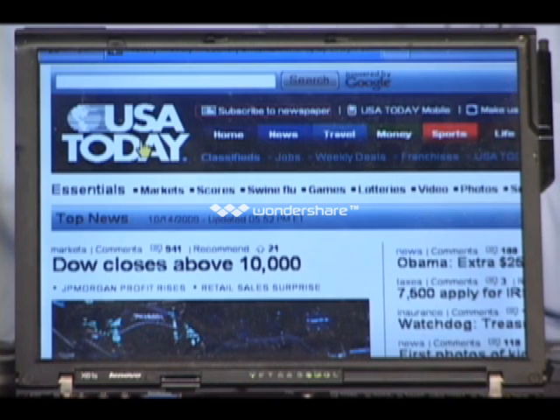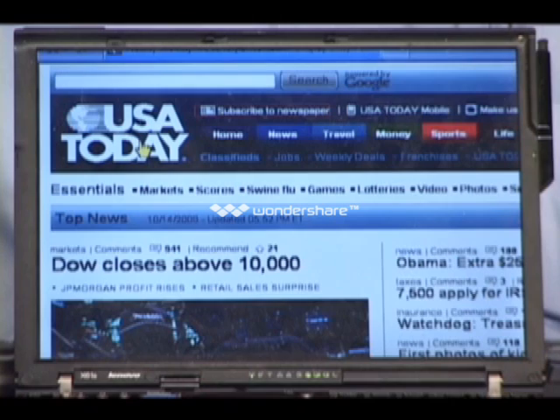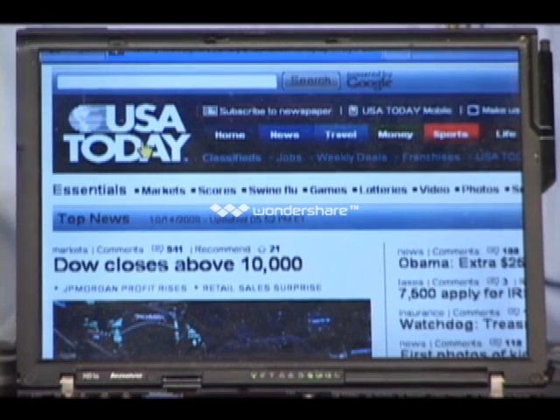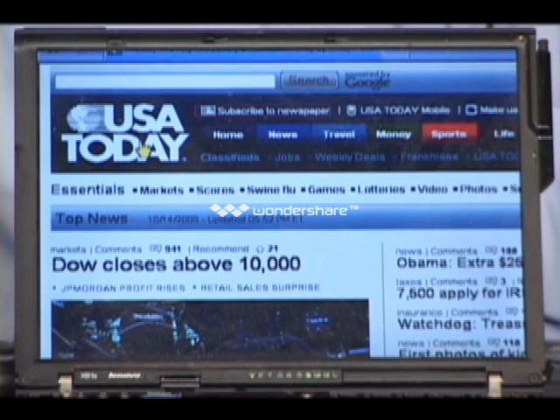Magic, however, has two versions. One is magnification only. The other is magnification with speech. Now, the speech version has not as much speech in it as JAWS does, because again, it assumes you see the screen and that you only need the speech to give you assistance, maybe to read a long document or maybe to hear things that you just don't want to have to look at all the time.